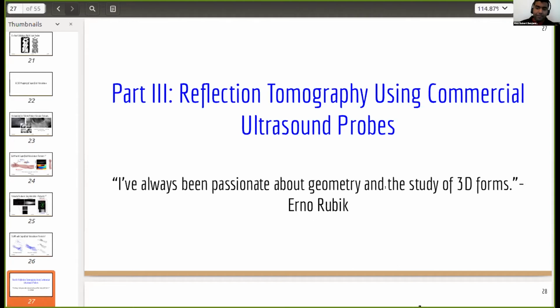It doesn't tell you much about whether it's diseased or not. So what we were after was, now that we can reconstruct 3D volumes rather than stitching together images, can we actually stitch together property maps? And for that, we would need to estimate 2D property maps. And in our case, we were focused on sound speed. Quick overview on why that makes sense.